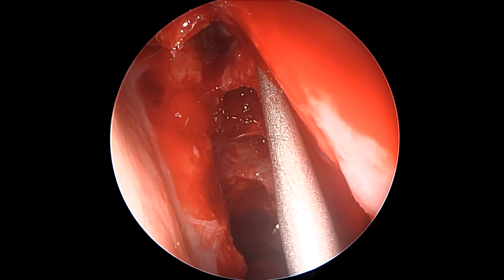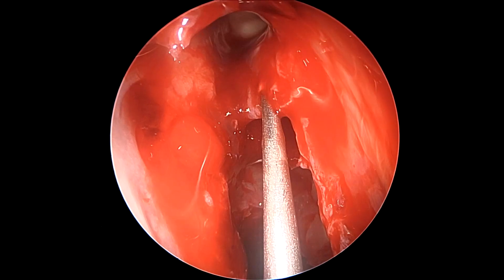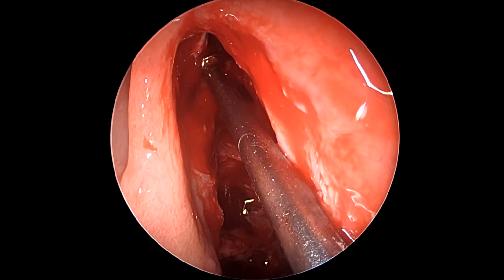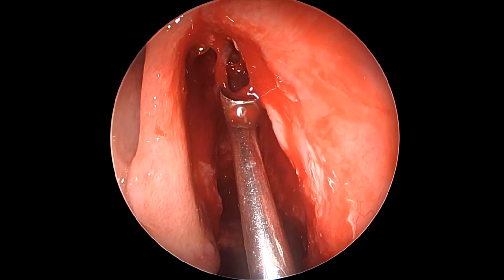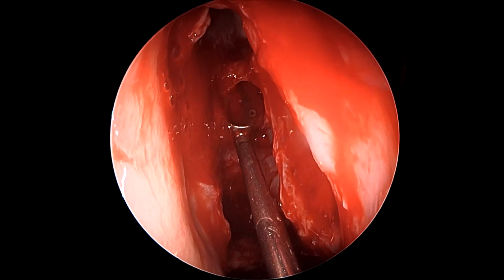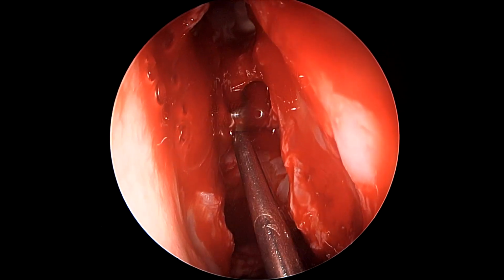So here we are using a very simple ball tip probe to increase our access inside the frontal sinus. You can see here the frontal ostium, the posterior table of the frontal sinus being very clear. Again, we are trying not to use any powered instruments inside this area, using either a blunt ball tip probe or the frontal sinus curette, but the curette we normally use with the direction anteriorly and not posteriorly to just enlarge the entry inside the frontal sinus.